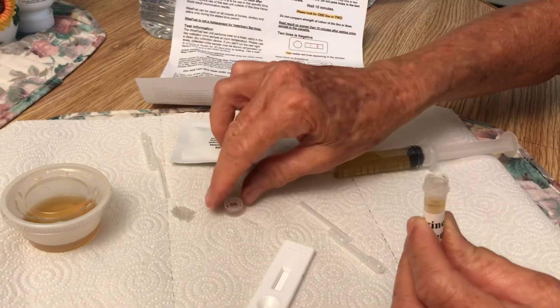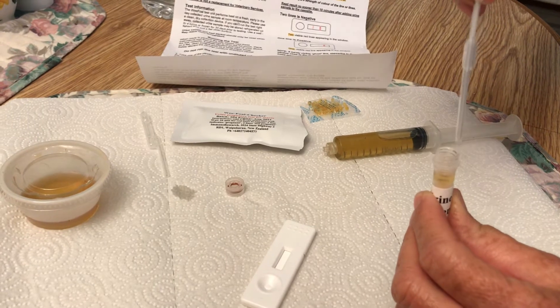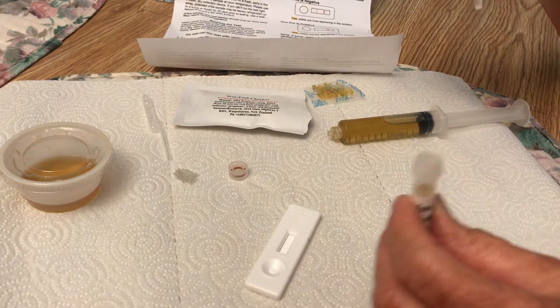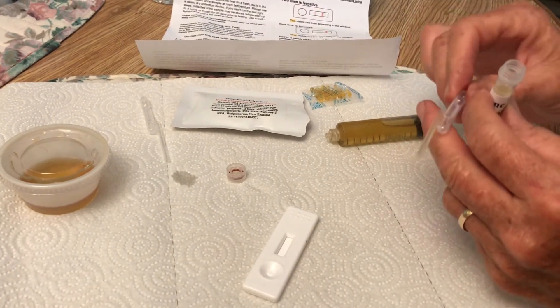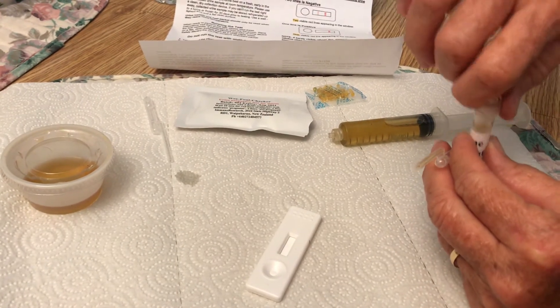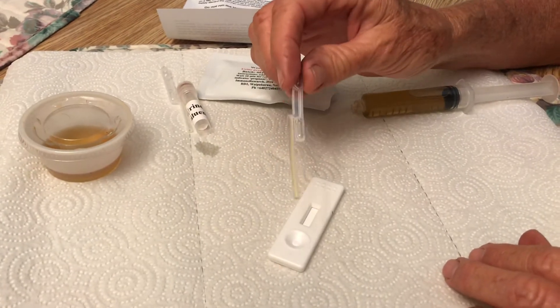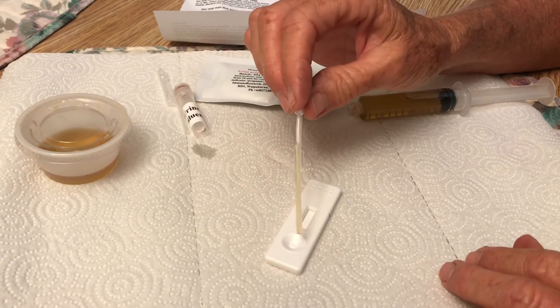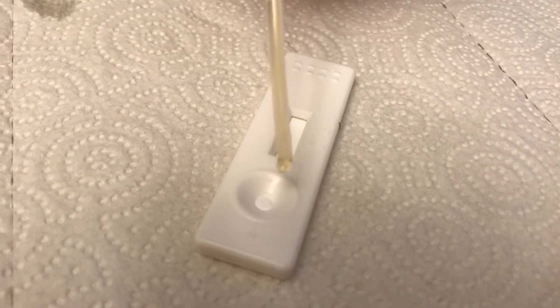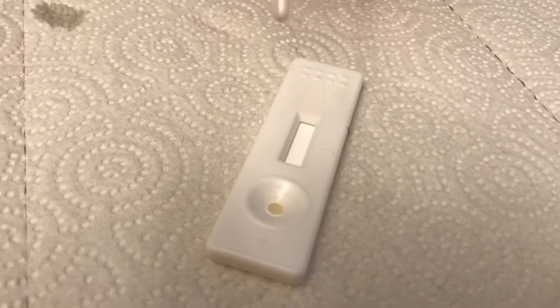Then you take the urine from here that has been diluted. Squeeze this other pipette bulb and get a straw full. Then take this pipette and, very slowly, one drop at a time, put drops in this little well. They say don't flood the well, so do this real slow.